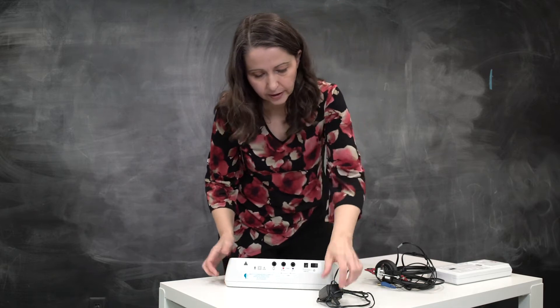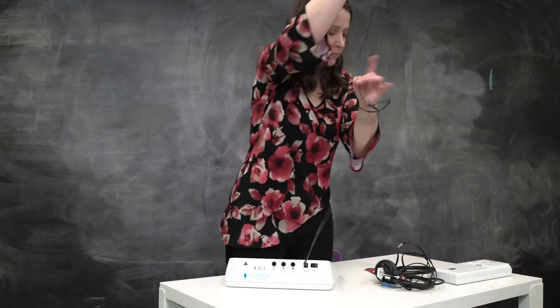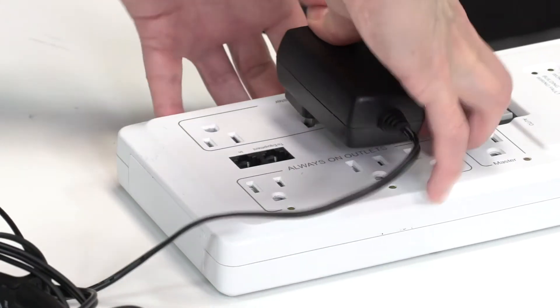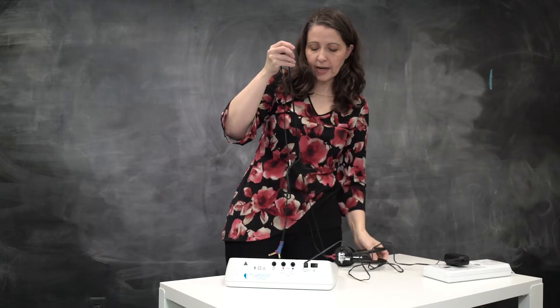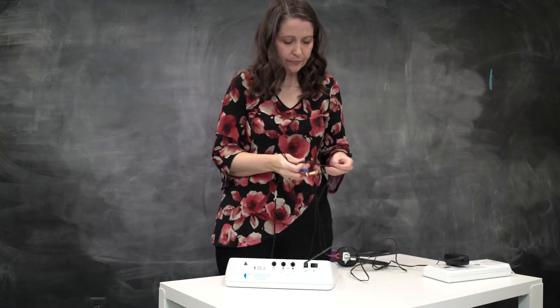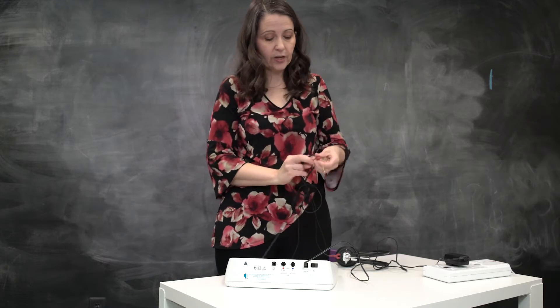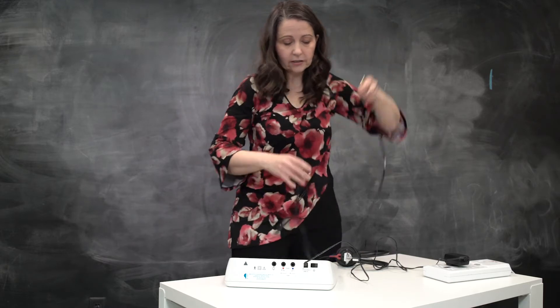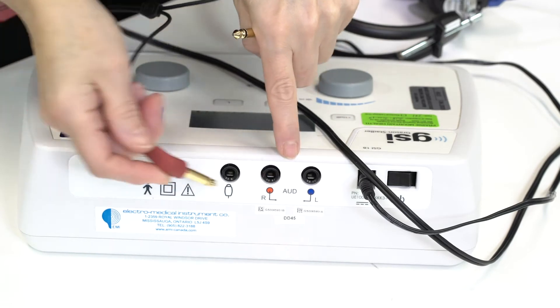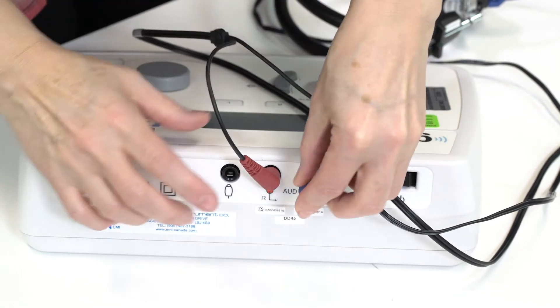The first thing we should plug in is the power cable. It goes in right here. There's a right side and a left side. The red side is the right side. Make sure that the cables are untangled. There's a red jack marked R — that's where the red one goes in — and the left goes in the blue slot.